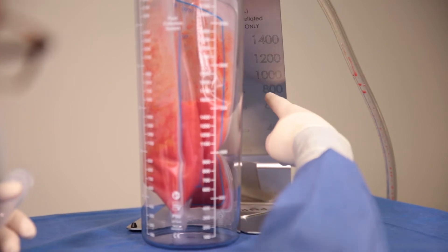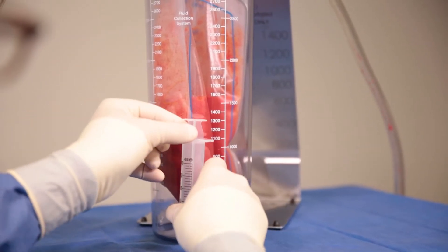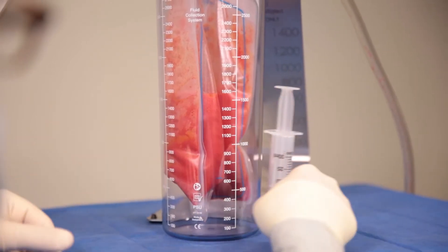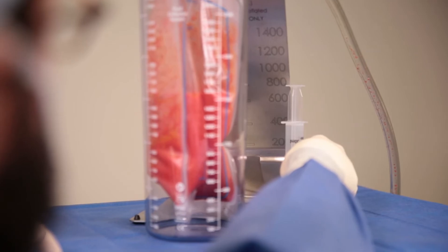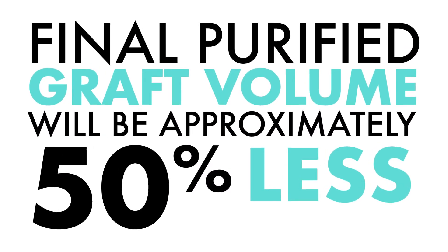To estimate the total amount of lipoaspirate, utilize the scale on the back of the easel at eye level or use an instrument as shown here. Keep in mind, after removing the excess waste fluid, the final purified graft volume will be approximately 50% less.